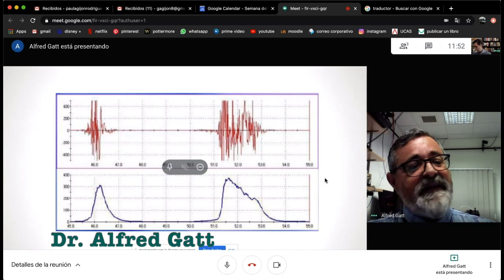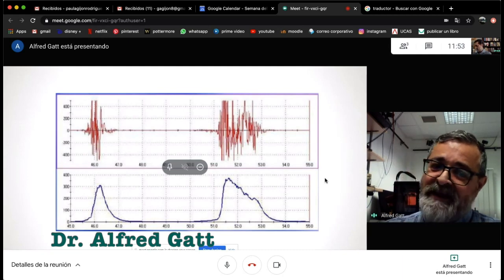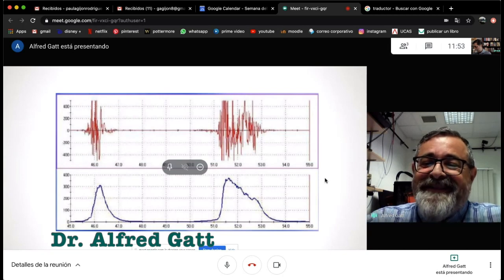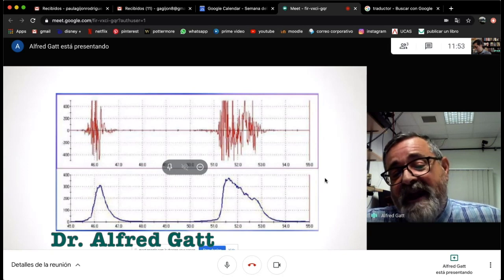As you can see, this root mean square has removed the negative component and provided quite a smooth signal from which we can get two main pieces of information. One relates to the timing of the activation, so when a particular signal started to be sensed. So basically, when that muscle started activation, and for how long that activation period was.